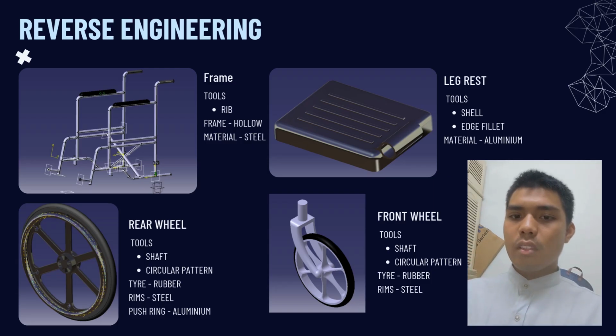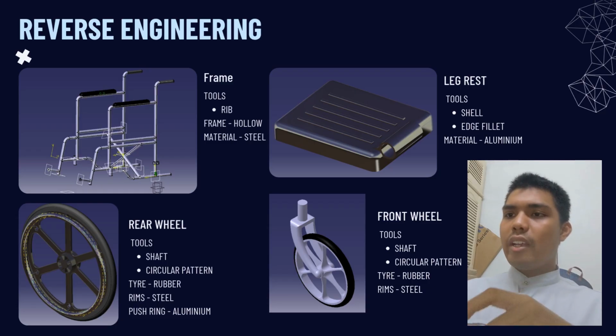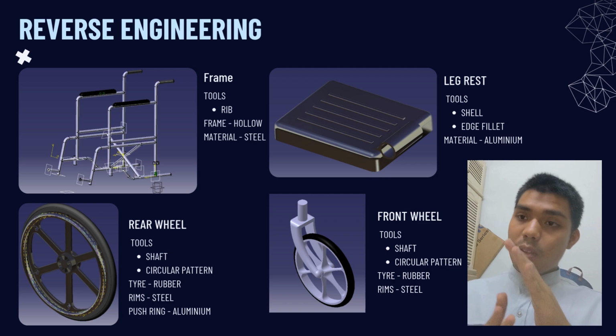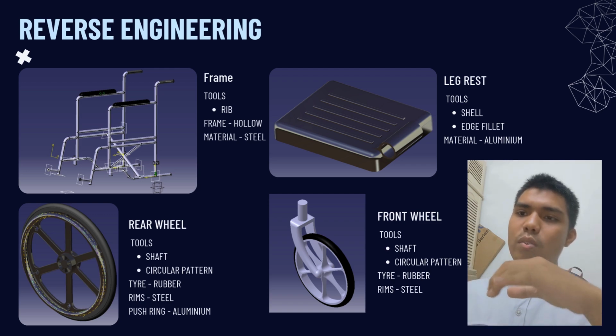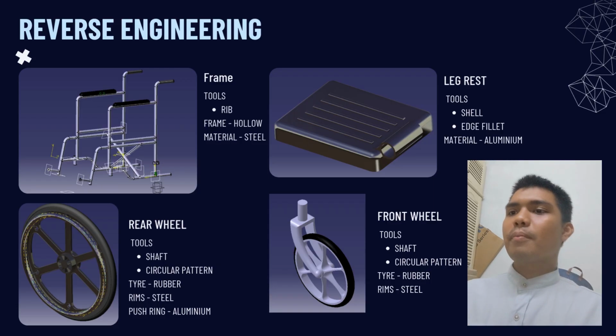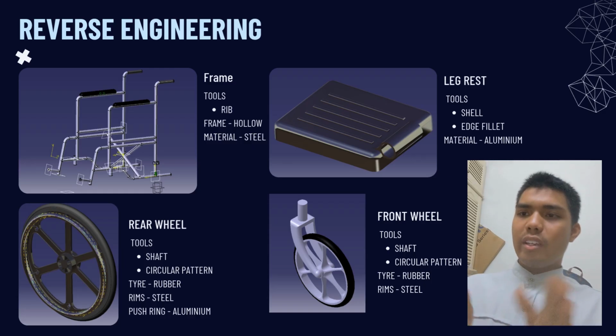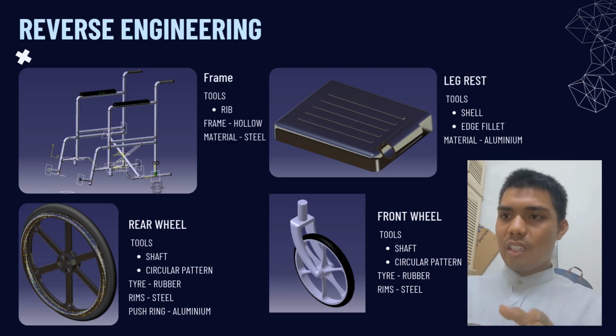The next one is the leg rest. If you look at the leg rest here, the bottom side is hollow, so we use the shell tool and an edge fillet to get a curved surface.